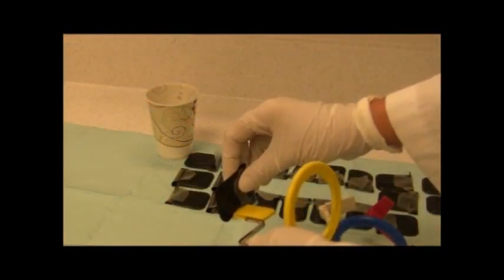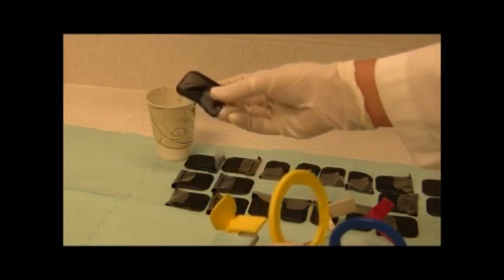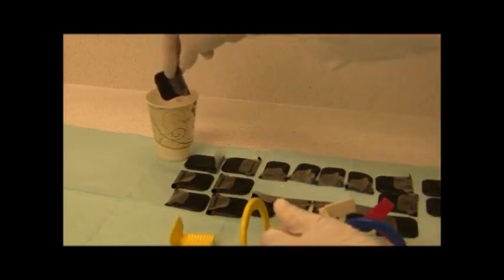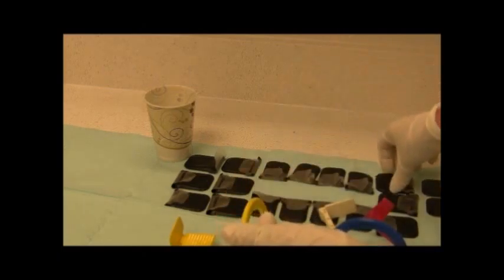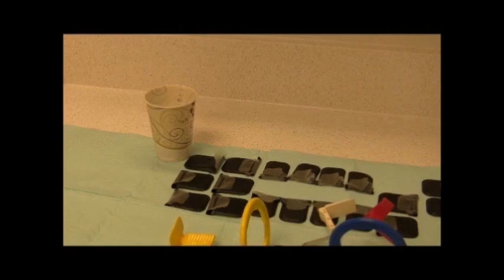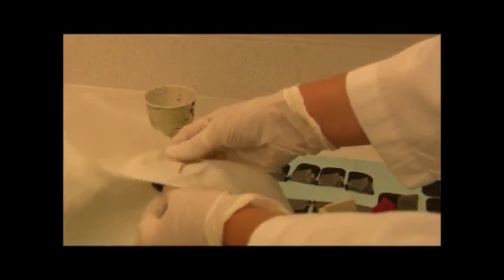After taking your radiograph to ensure proper infection control, simply place your phosphor plate within your clean cup without touching the cup. If you notice that there is a significant amount of saliva on your phosphor plate, simply dry it off with a paper towel prior to dropping it in your cup.